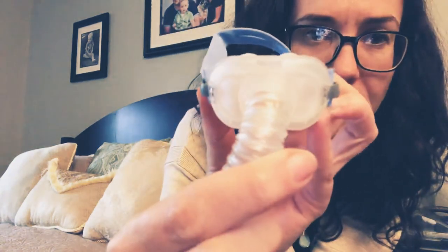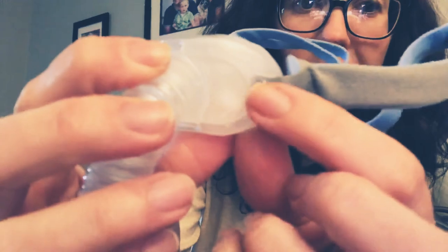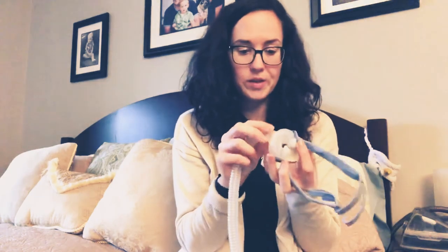Last but not least is the ResMed P10 nasal pillows. This one's a little bit more tricky because when you look at it, you really don't see any holes. You've got to look really close — see this mesh here on either side? Those are your exhalation ports. When you put your mask on, put your hand right in front of the mask and you'll feel that air coming out. Exhalation ports are extremely important — when we exhale, bad gases have to have a place to be released.